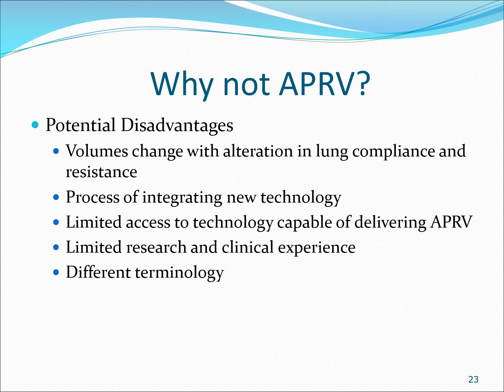So the whole point of this is you have to be a little bit more interactive with the ventilator. Not crazy interactive. It's not like you're making 5 changes a day, but you might make changes once a shift, or you might make a change once a day, or you might not make changes. But the bottom line is, because lung compliance and resistance change with the patient, you have to be ready to change pressure settings on the ventilator, and that's due to tidal volume changes.